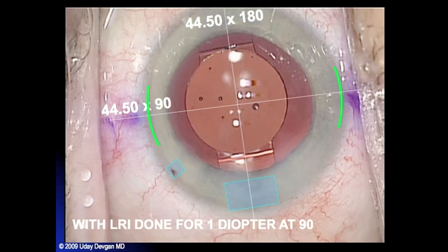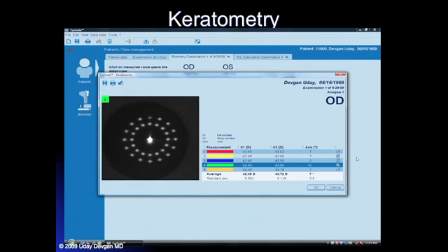As an example here, there's a patient with an LRI done here at 90 degrees after implantation of a presbyopic lens. Another thing in the keratometry is we want to have multiple measurements, and this is done at 2 ring sites. This is a 1.65 and a 2.3, so the average of this is just under 2 millimeters. Now we actually want to know the central corneal power. So the narrower the optical zone is, the better. Our manual keratometer is only about a 3.5 millimeter optical zone. The Haag-Streit's a much tighter zone.